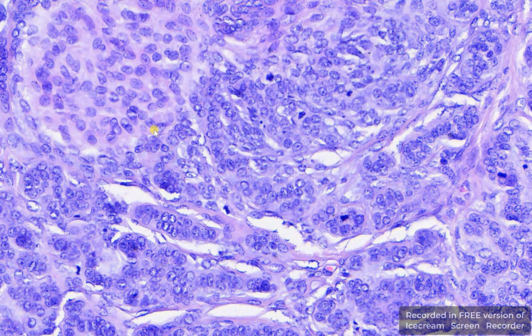This is an epithelial neoplasm of a dog. In this particular field of view, which is a relatively high magnification, I measure here the nucleus — the nucleus has around 12 micrometers in diameter, so it is a very high magnification.